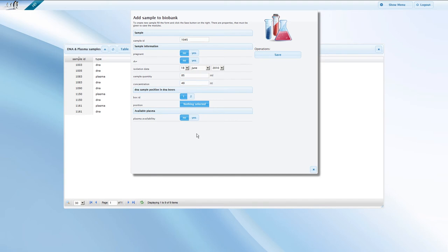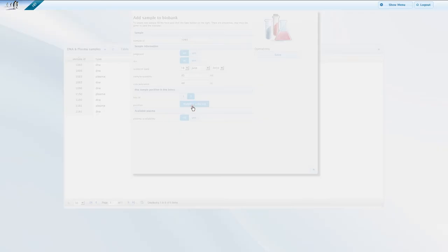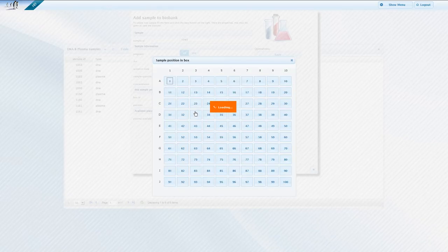Setting the position of the sample in the freezer is an important part of the data entry. To do this, simply click on an empty slot, marked in blue, in the table.